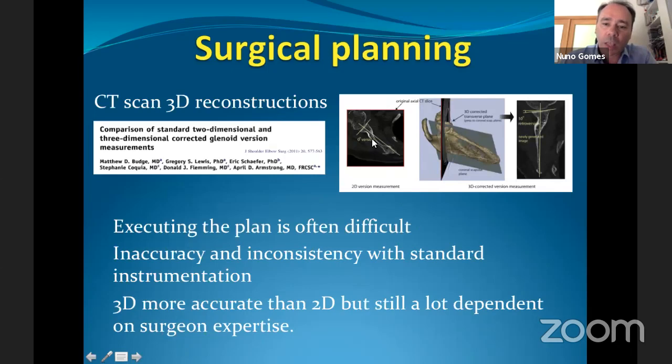When using 2D reconstructions, you may be misled. As seen in these images, a 2D cut may appear to show zero degrees of retroversion, but when you have a complete 3D reconstruction of the scapula and can define its plane, you realize the version is actually different.